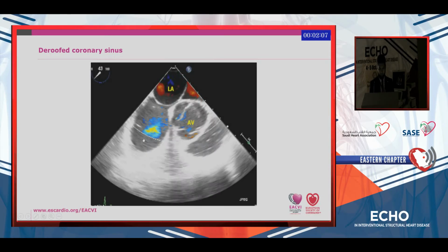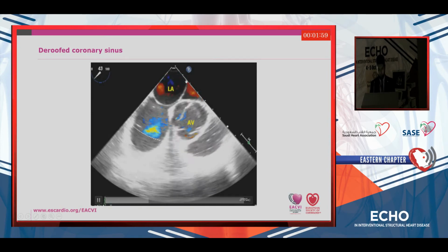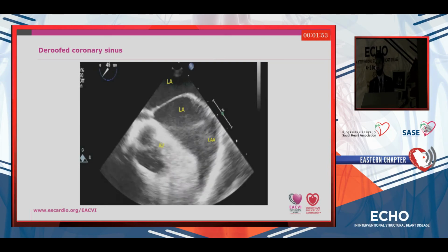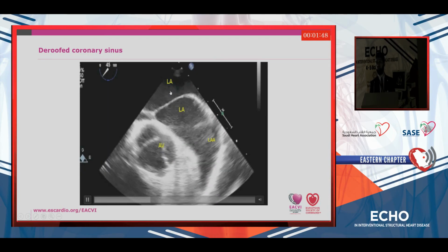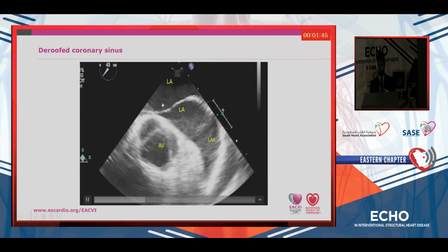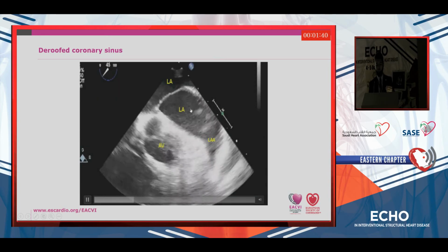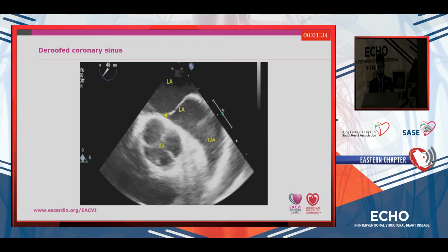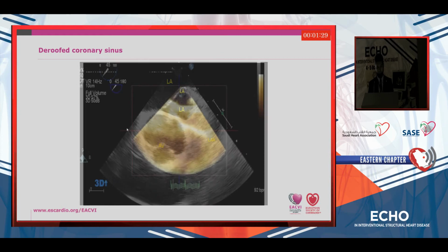The video is coming and going, okay? So there is intermittent shunt from the left side to the right side, and the septum is curving into the left atrium. So I thought, okay, just go for the other side and see where the septum is going. Septum is attached to the tip of the left atrial appendage, the Coumadin ridge, separating the left atrium into 2 chambers, something like cor triatriatum, the left atrium. So we have superior portion of the left atrium containing the pulmonary veins, and we have an inferior portion with the left atrial appendage. So this communication is between the lower part of the left atrium and the right atrium.